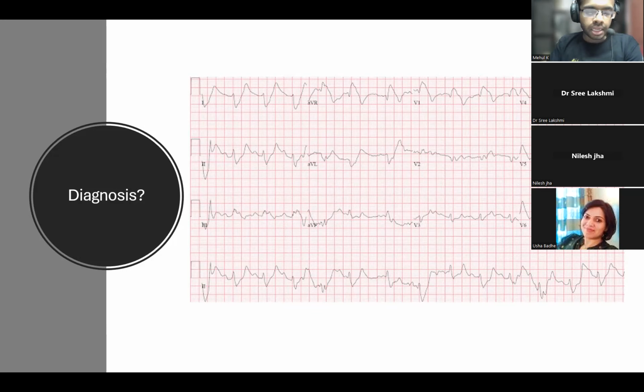It can actually mimic the Brugada pattern as well. But this is basically hyperkalemia. This is severe hyperkalemia. This patient's potassium was somewhere around 9. So don't get confused by this. If you try to treat this as an SVT or a VT, the patient will die. This patient needs immediate hyperkalemia therapy. Don't wait for the VBG report. This can only be one thing, hyperkalemia. Don't get fooled into thinking that this is something else.